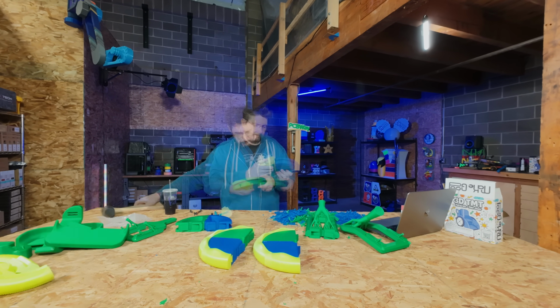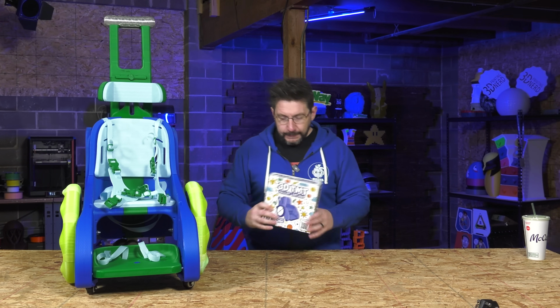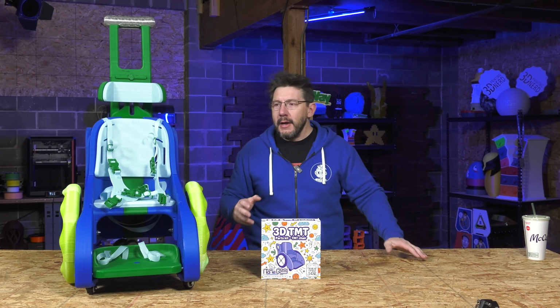And the reason I'm telling you about it is because you can make one yourself. It doesn't take that much filament, all things considered. There is a kit now where you can get the non-printed parts easily delivered to your door. And at the end of the day, you're doing something amazing for a family in need.